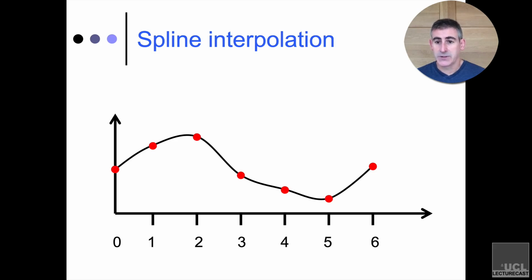And spline interpolation is slightly better than linear interpolation for a variety of reasons, basically around the idea that probably head motion was smooth. It isn't the case that somebody was moving in a sort of robotic way. They were probably moving in a much more smooth fashion. So it's a better estimate of what people are actually doing. And again, same thing. You can interpolate by figuring out where you wanted to collect the data, go up to that point on the curve and take that value and replace it with what's in your image.